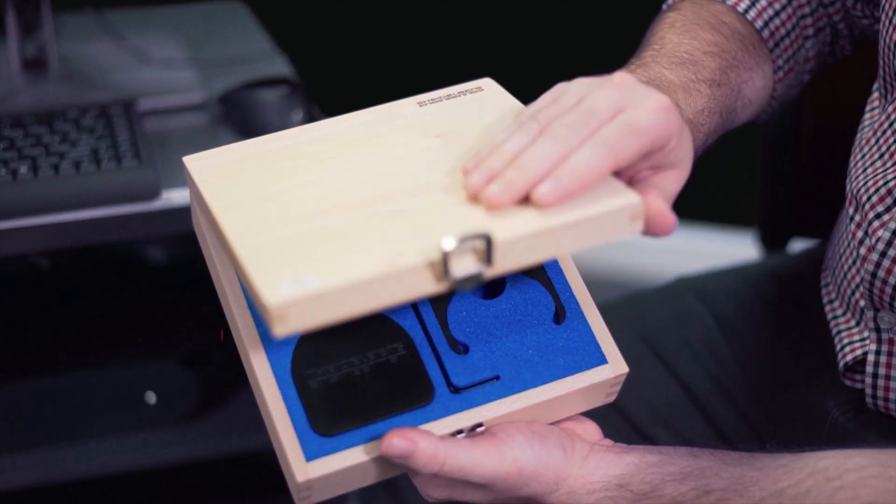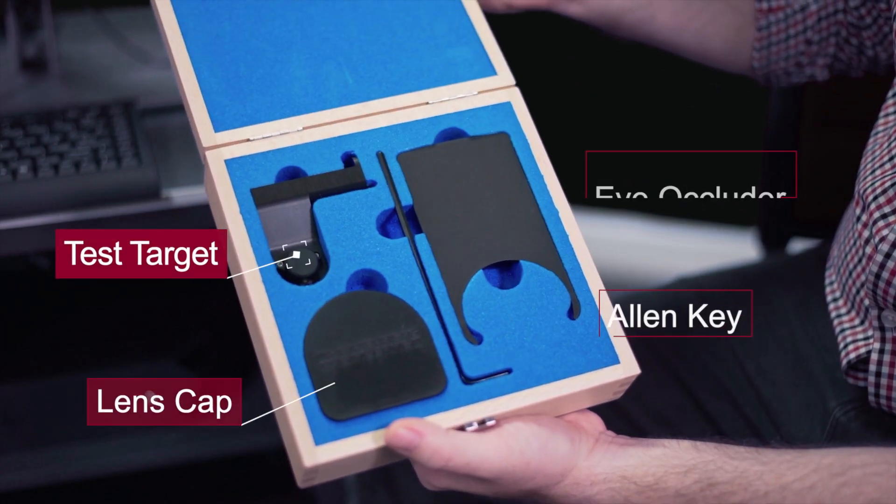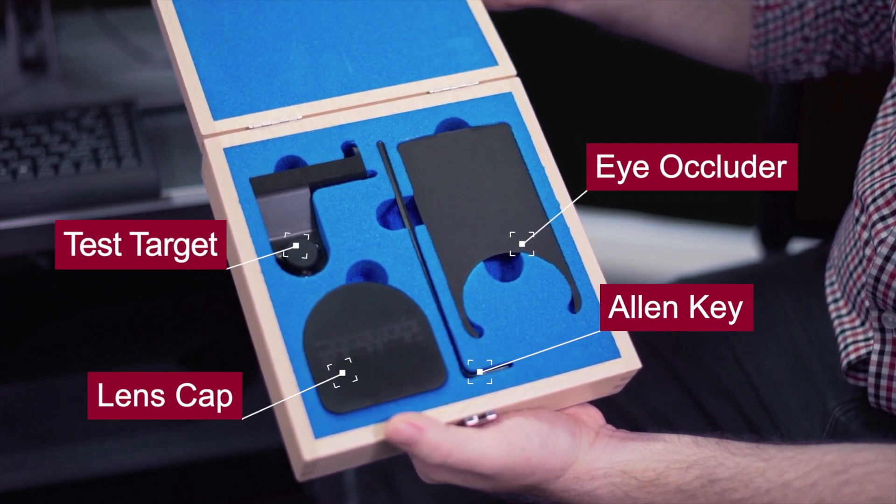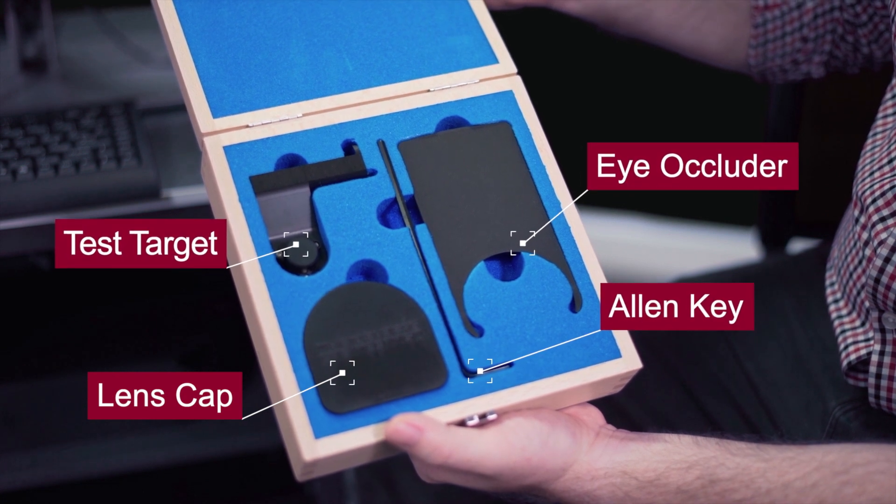Each device comes with an accessories box which contains the test target, the eye occluder, the lens cap, and the allen key.